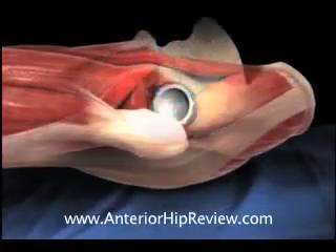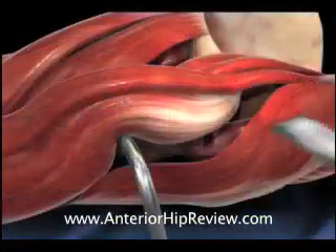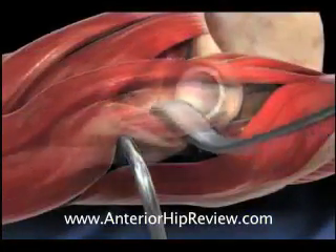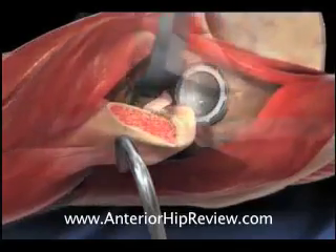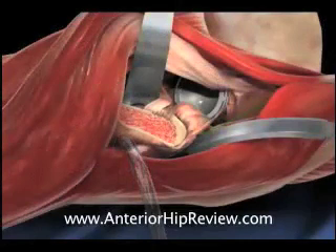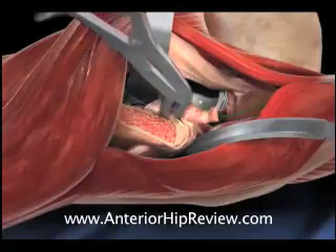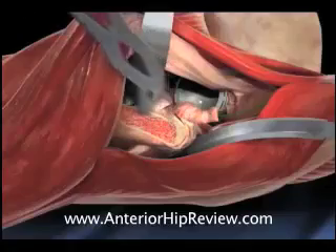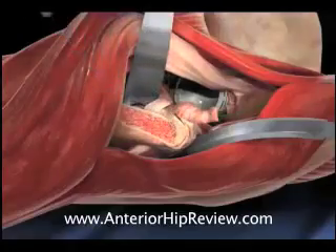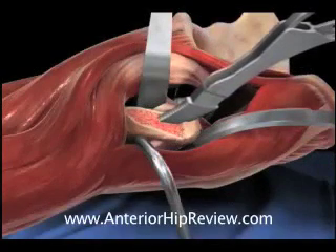The hip is then exposed by flexing the table and placing soft tissue retractors about the proximal portion of the femur, facilitating exposure of the proximal femur in preparation for femoral broaching. The soft tissues at the superior corner of the exposed femoral neck are released, and a rasp is used to remove any remaining residual neck. A series of cutting broaches are then impacted down the length of the femoral canal, preparing the femoral canal for final implant insertion.